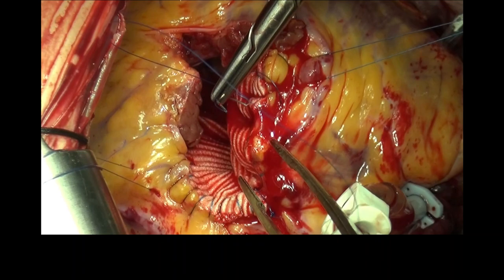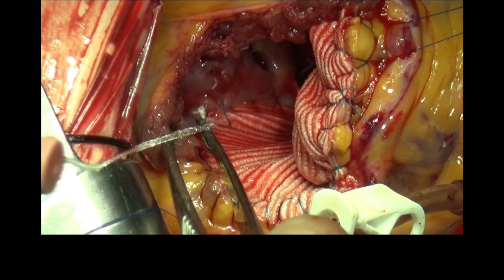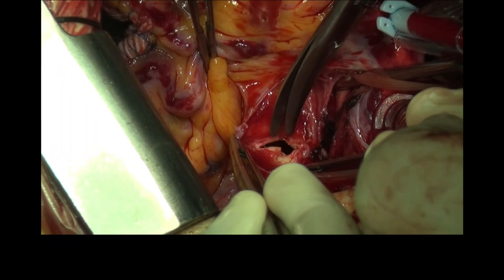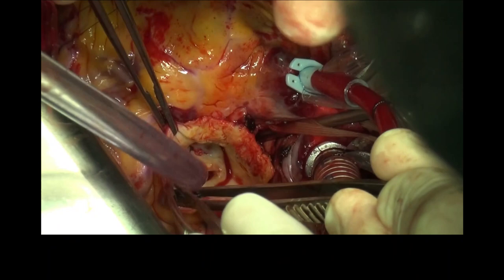Additional sutures were applied to the bleeding points at the VSD patch, checking by giving an extra small portion of cardioplegia. Then the pulmonary artery was carefully opened, an extremely stenotic pulmonary valve was observed, and this pulmonary orifice was closed by a double layer continuous suturing technique with 4-0 Prolene.